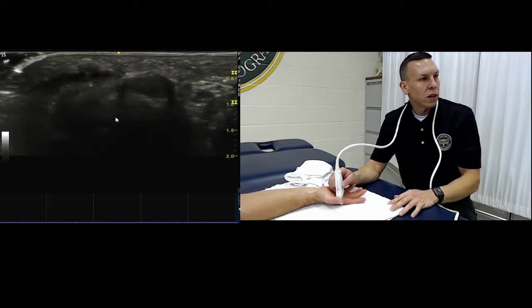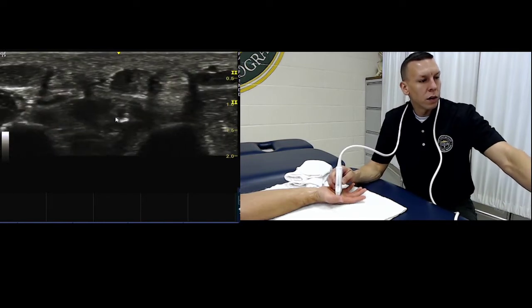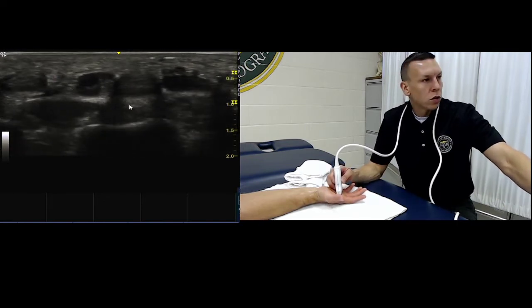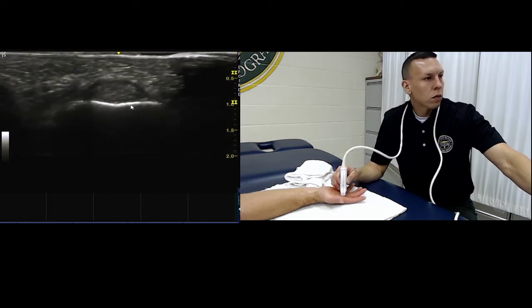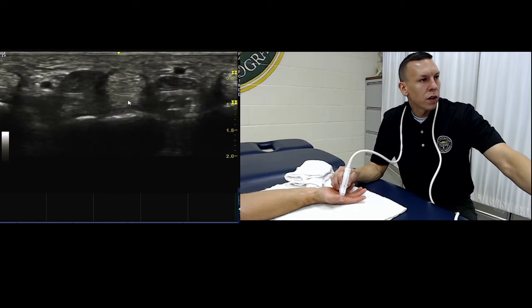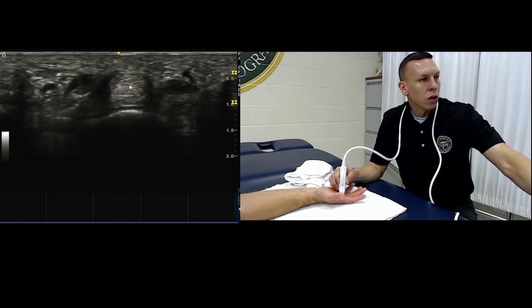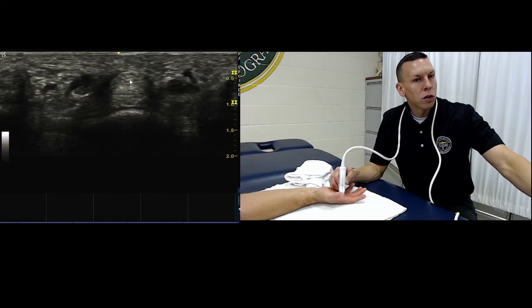You should be able to identify two different tendons here, above and below, and that is your flexor digitorum superficialis and profundus.